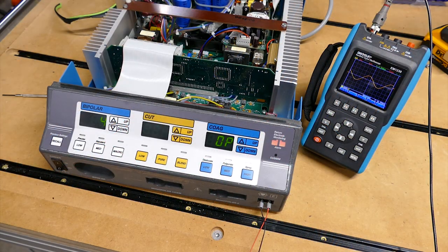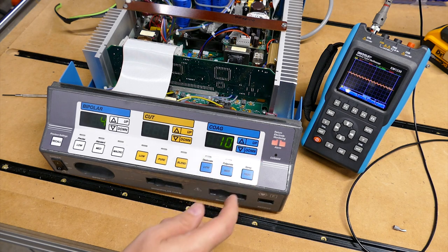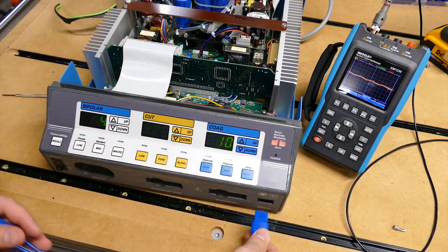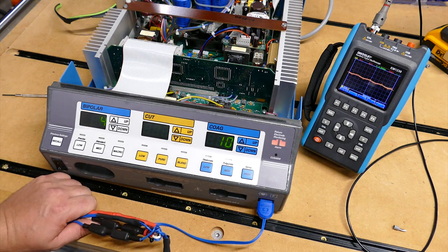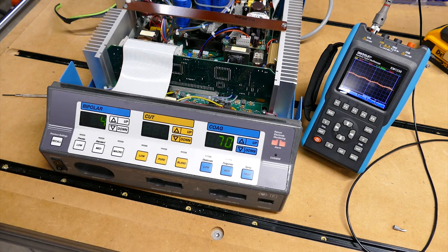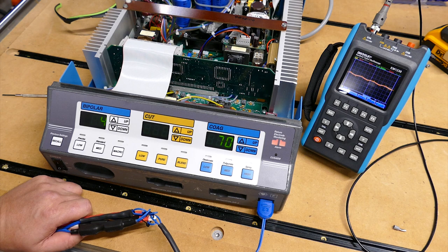Here you can see the front control panel. You're going to disconnect your oscilloscope. And over here are your calibration levels. So you press the up key once and it should say 10. And what you're going to do is find a 10 ohm load and you're going to place it here in the calibration port or your patient return electrode port. I go ahead and let it sit there for about 10 seconds. And then I press the up key. Now it's asking for 70 ohms. Here I've got a 70 ohm pre-made key.